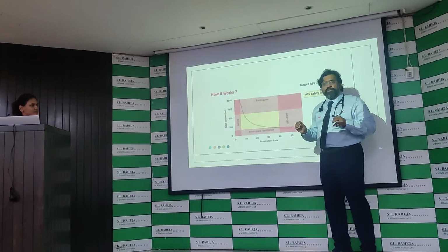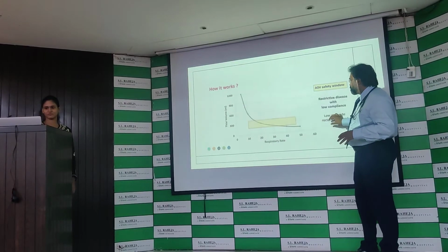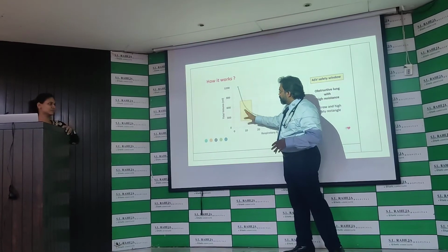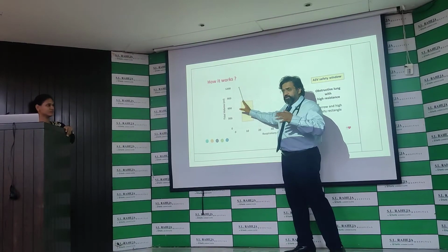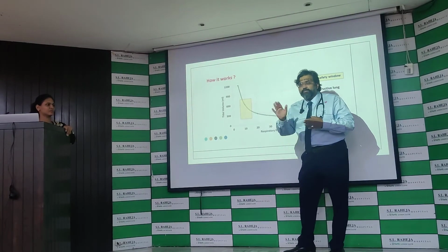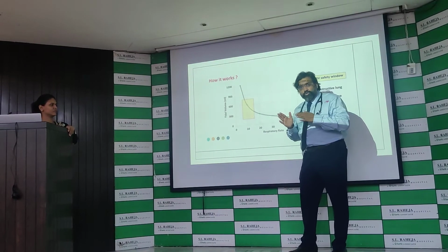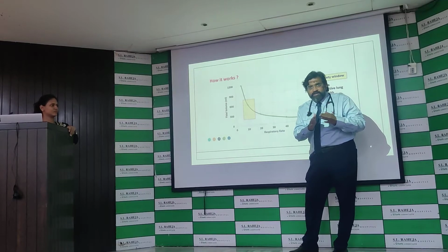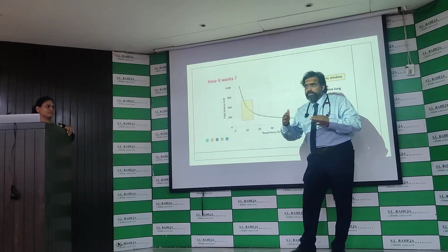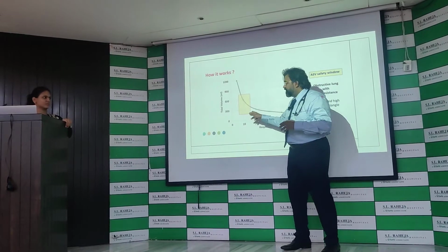So if you have an obstructive airway, then the entire thing will be like this. Obstructive will be like this, where your tidal volume should be higher. It takes a call on giving more tidal volume but reducing the RR, because in obstructive airway disease, expiratory airflow has to be much higher. Expiration should be much longer. So what it does is give you lower respiratory rates and higher tidal volumes. When you do a COPD lung ventilation, you want the volumes to be slightly higher and you want the RR to be lower. So it is actually doing that.